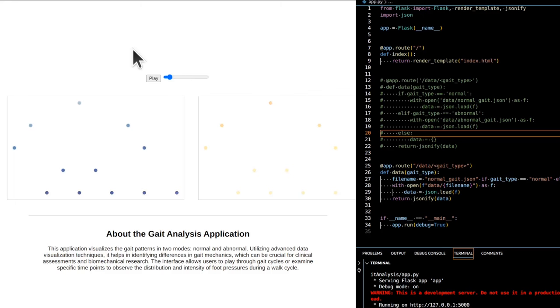4. Plotting. The foot outline and sensor positions are plotted in a 2D space, with the outline drawn as a curve and sensors marked as distinct points. This summarized approach ensures the model captures essential anatomical features and provides a functional visualization for analyzing foot pressure distributions. Despite challenges in achieving perfect anatomical accuracy, the focus on key pressure points and smooth interpolation aims to create a useful tool for gait analysis.